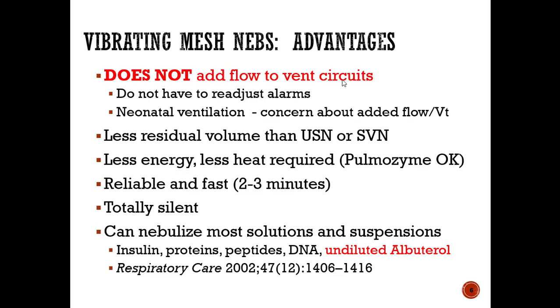So these things are huge. And when they came out with these, this was a very big leap in treatment advantages for those little peanuts. Less residual volume than the ultrasonic neb.